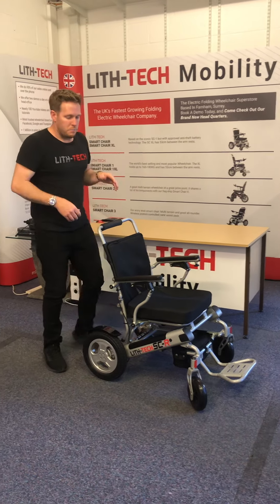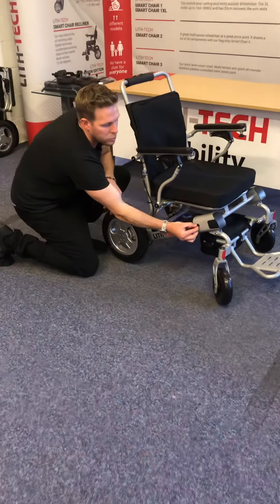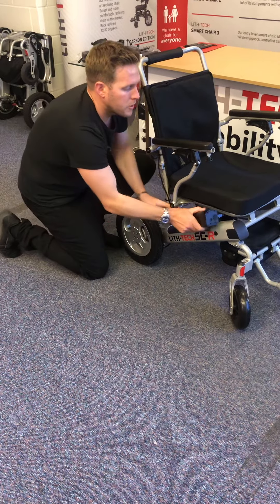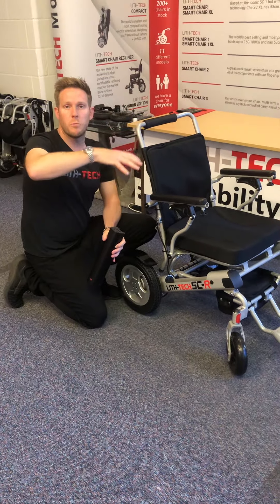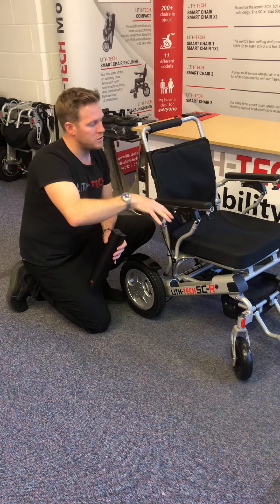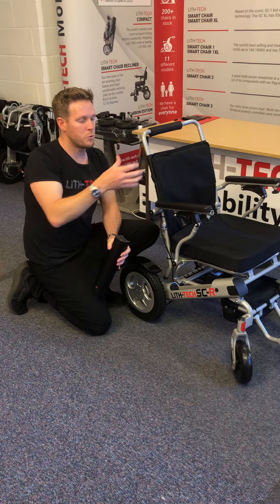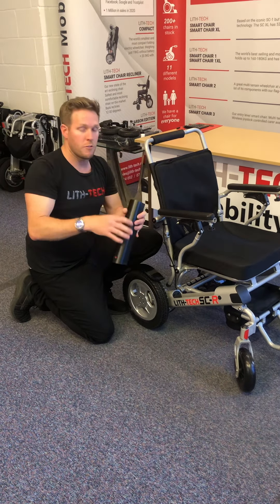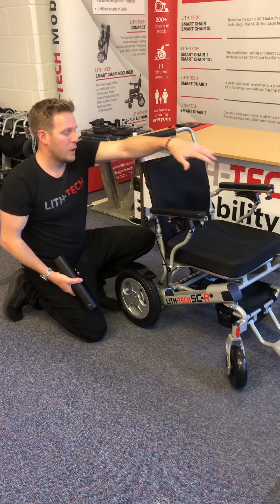The batteries are in the sides — this is another new battery style. Rather than a key, it's just a twist, and then you can pull the battery out. You can charge directly through the joystick when it's attached, which will charge both batteries together. Whatever batteries are in the rack, the chair will draw power from them. If you've only got one battery in the chair it will use that one; if you've got two it will draw from both. So when you're charging through the joystick it will charge both batteries.